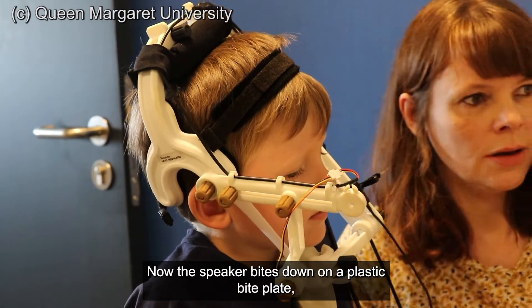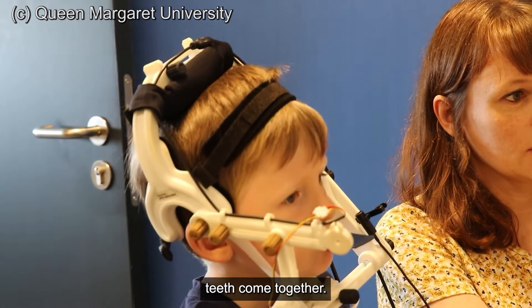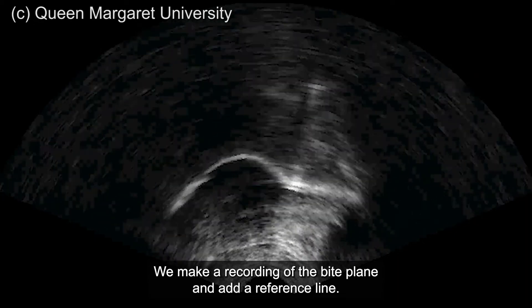The speaker bites down on a plastic bite plate, which shows us where the top and bottom teeth come together. We make a recording of the bite plane and add a reference line.